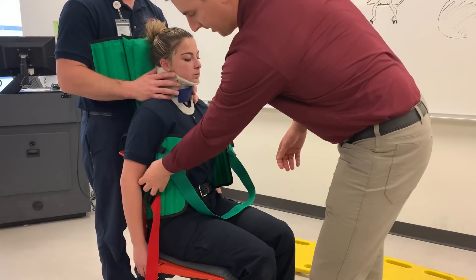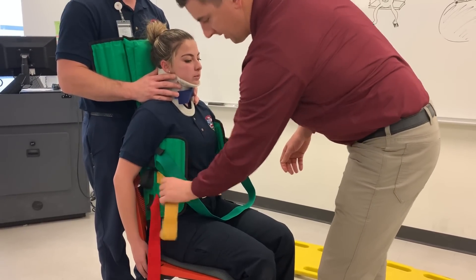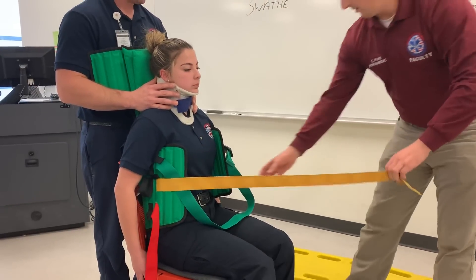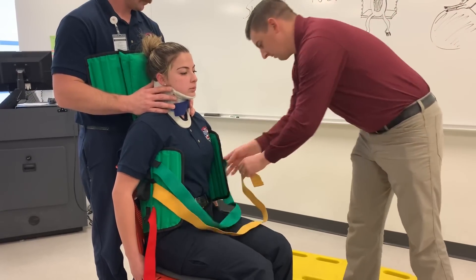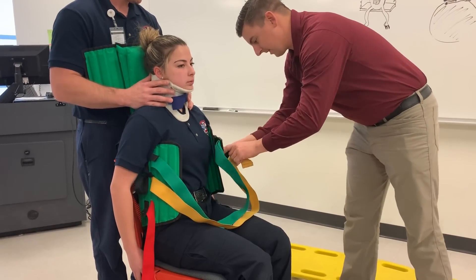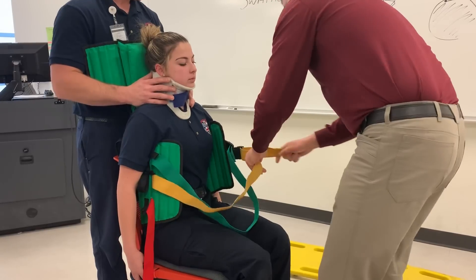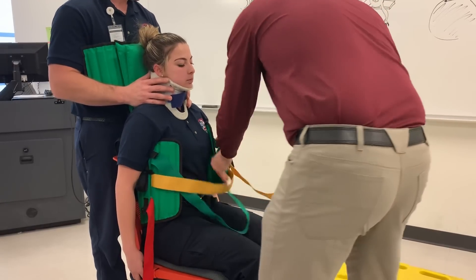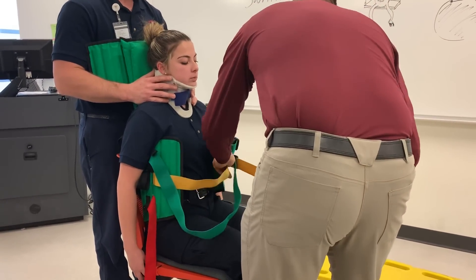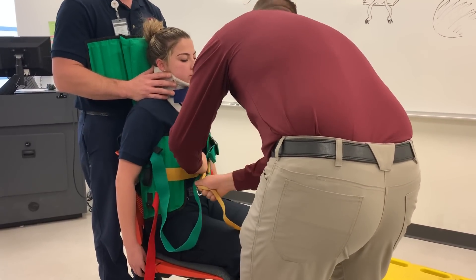You can use the acronym 'My Baby Looks Hot Tonight' for middle, bottom, legs, head, top — for your tightening order. When tightening, you feed and pull.